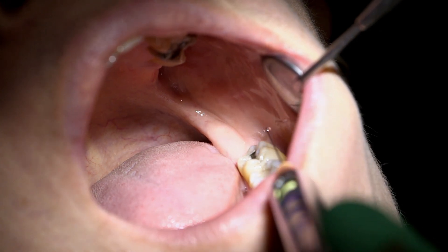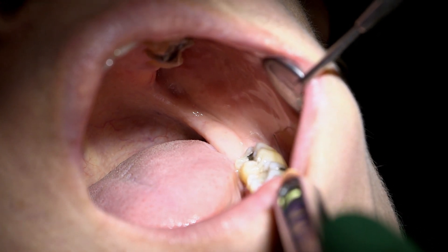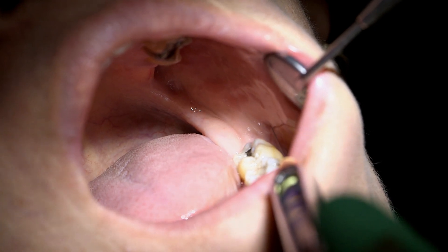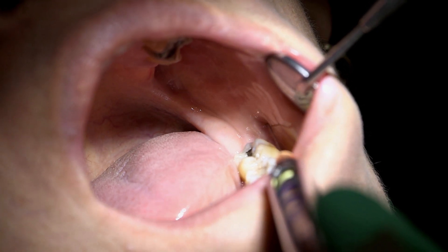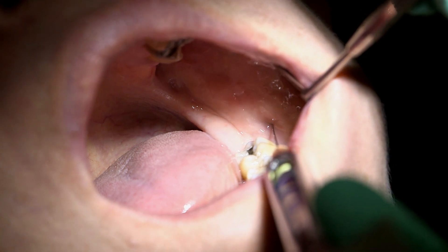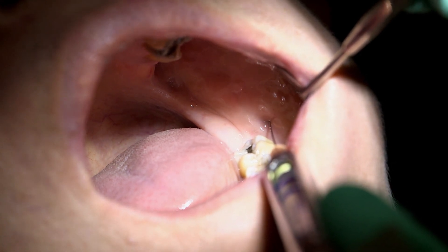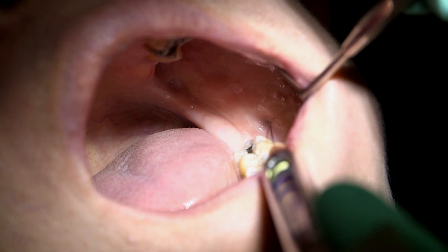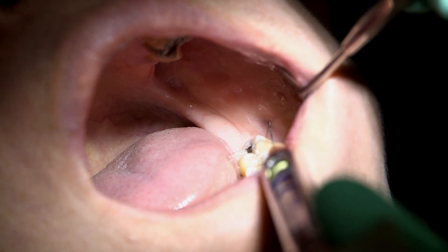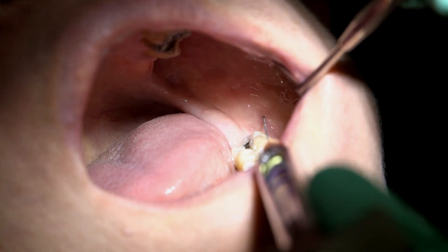Orient the syringe so that it is parallel to the occlusal plane on the side of the injection. Insert the needle 2-3 mm and deposit approximately 0.2-0.3 ml of solution. Withdraw the needle carefully.